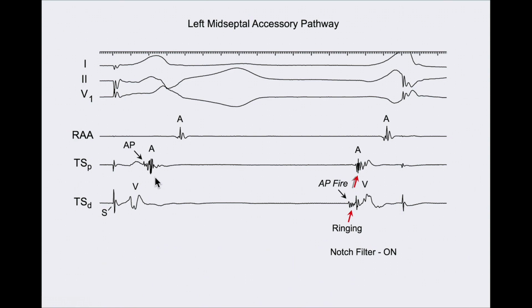It's a more significant problem here. Here, it only differs by about 4 milliseconds. So that may not be that big an issue when it comes to timing. But if you look over here, if we take the first rapid, this would be the signal that we would time the electrogram. But I suspect this was a small signal that is far field, and that really this is the local activation, but that this signal was made sharp and looking like it's the real timing signal because of the notch filter. So we elected to turn the notch filters off to complete the mapping.